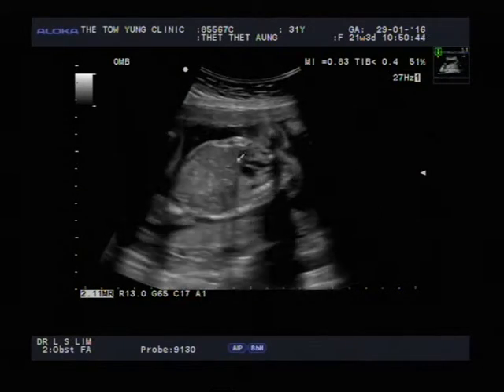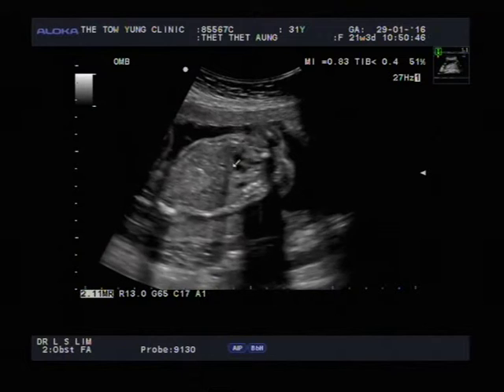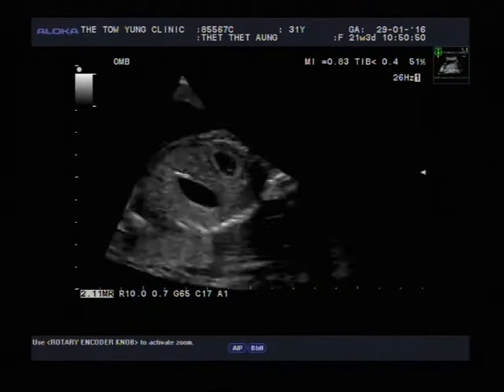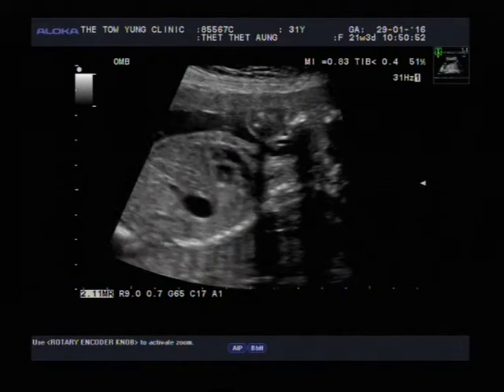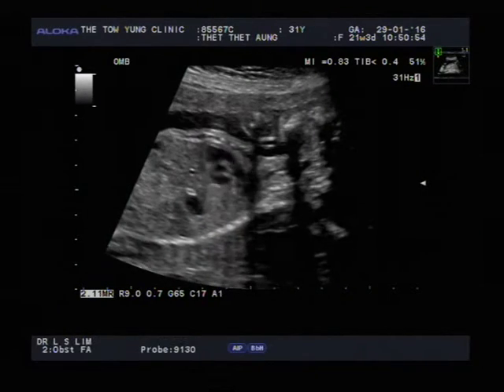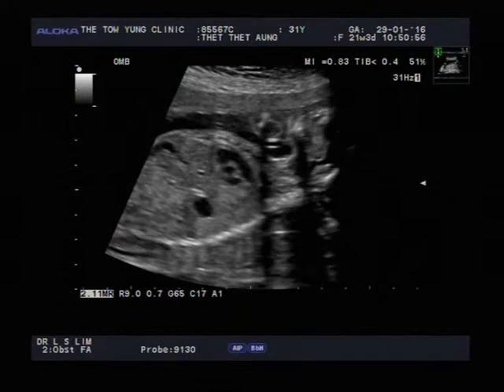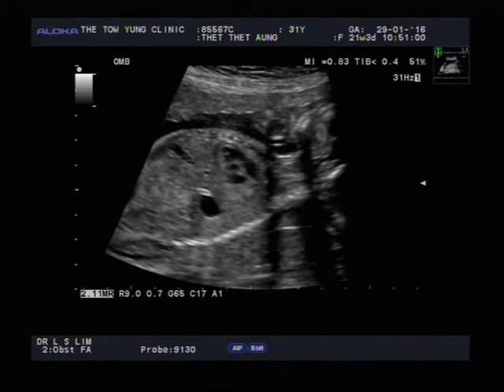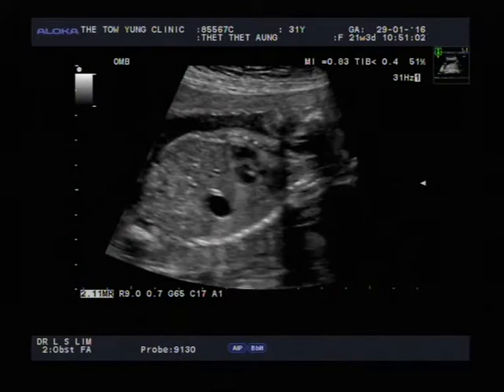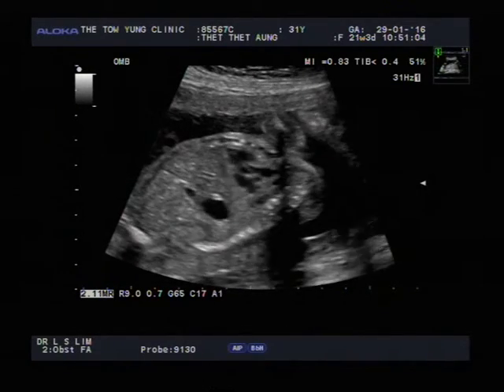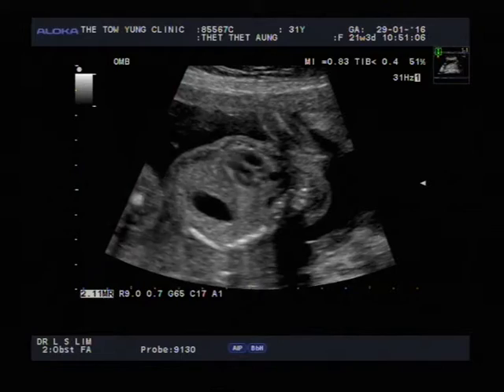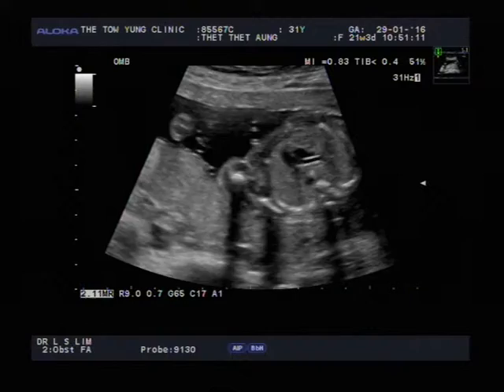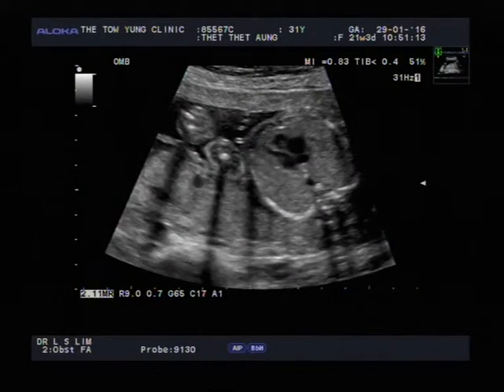Let's get a closer look at the baby's heart. I'm going to enlarge the picture a little bit for a closer look. This is a view of the baby's heart — the heartbeat is quite fast, but that's perfectly normal. A baby's heart always beats very fast. I'd like to show you the four chambers of the baby's heart from another angle.